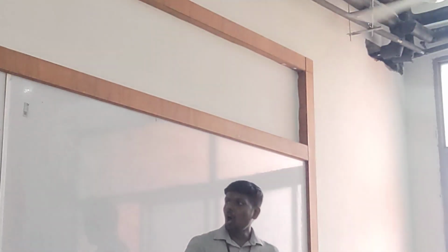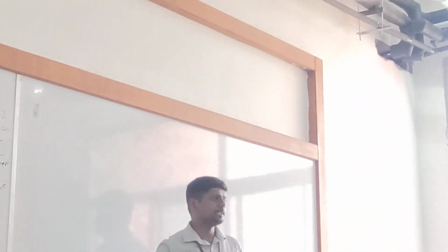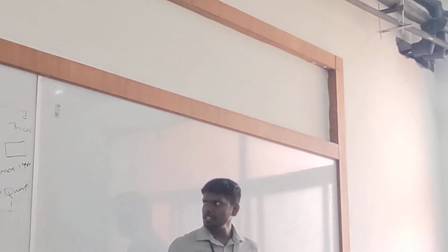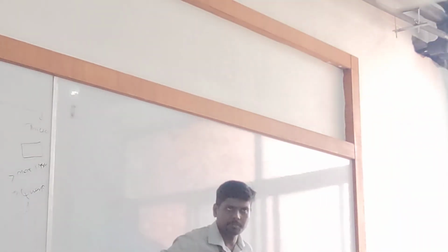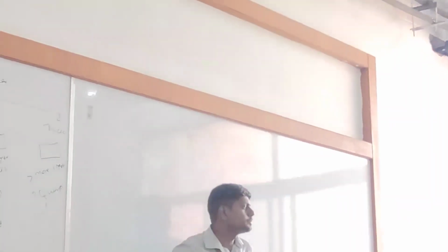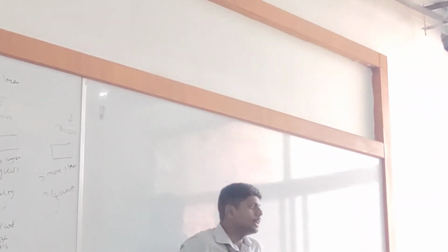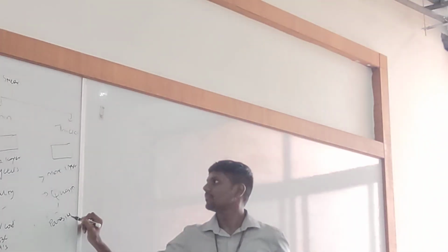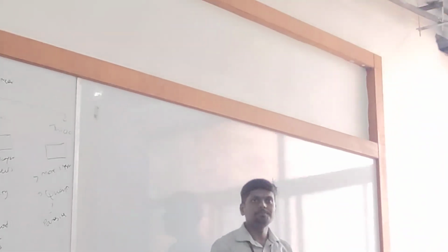All these things can be detected by a simple thin blood smear. Is it clear? Very good. Then the next one is the thick blood smear. What is the purpose of a thick blood smear? Any idea? This is not for counting cells. Then what is the purpose? Very good, for detection of blood parasites. Blood parasites will be detected in a thick smear.